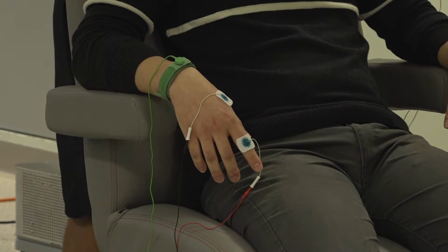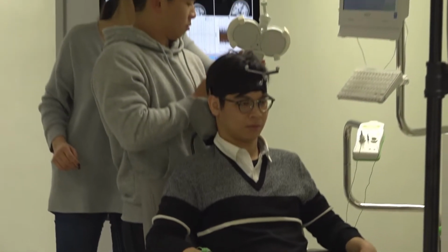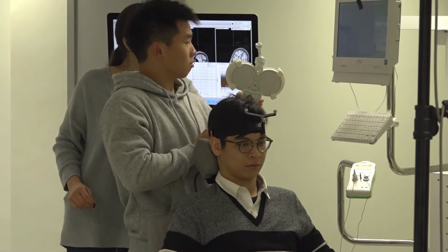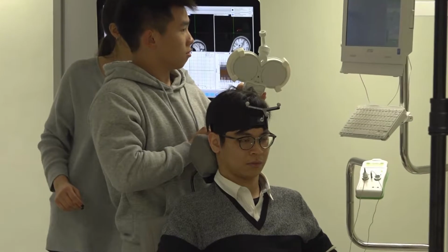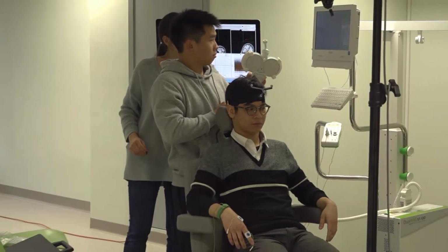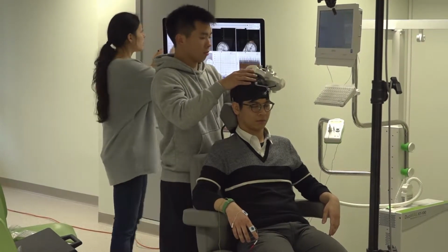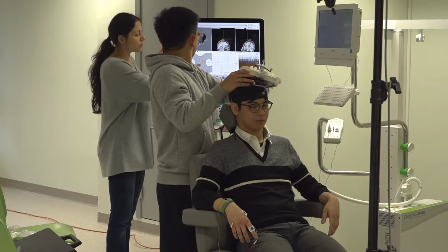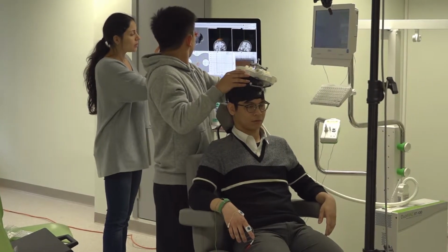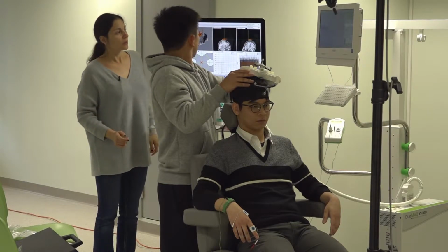Wait. Great. Fantastic. Now, don't. I want to reduce it. So probably this is a very good spot. And then you try again, and now I have selected exactly. Now you try to locate it exactly. Very good. Yeah. Try there.